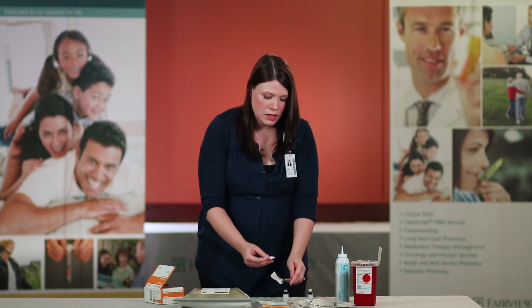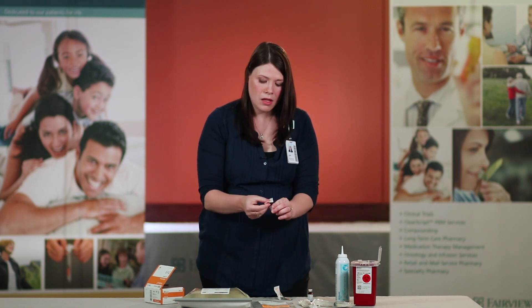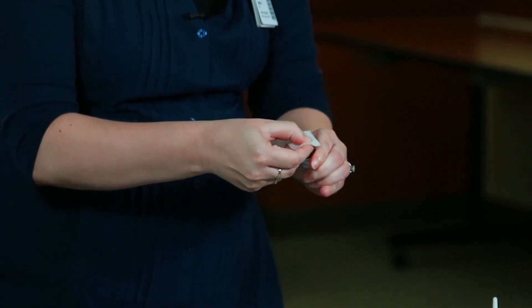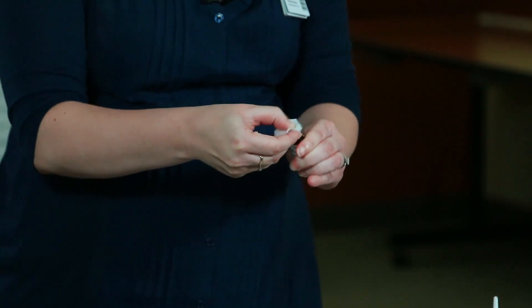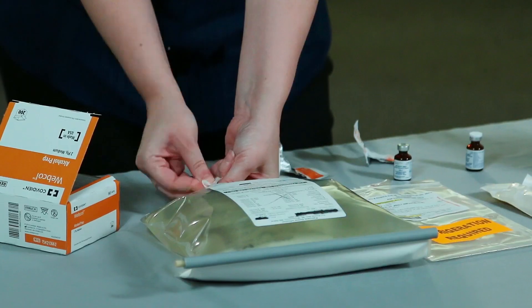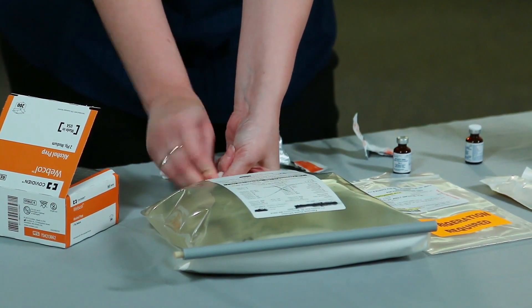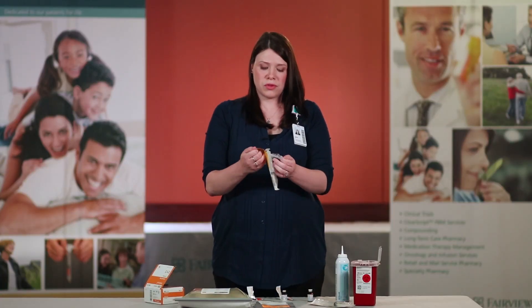The first thing you want to do is pop the top off of your first vitamin and scrub the port of the vitamin for 15 seconds using a good scrubbing motion. Now, using a fresh alcohol pad, scrub the port of your TPN for 15 seconds using good friction and scrubbing motion.